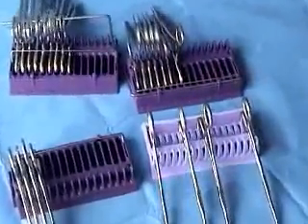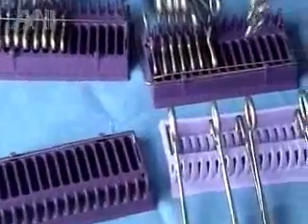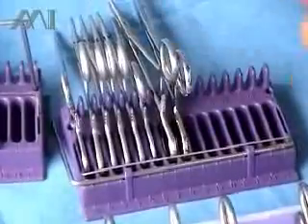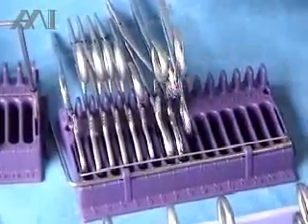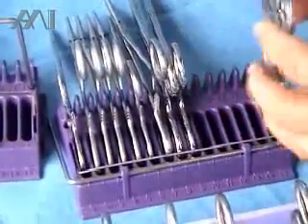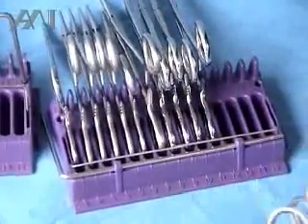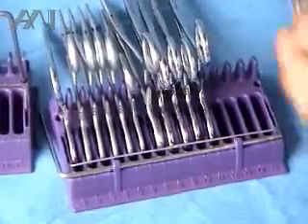At the end of the procedure, all the instruments are deposited back onto the trays one by one, in no specific order. You just basically want to fill all the gaps and all the slots.